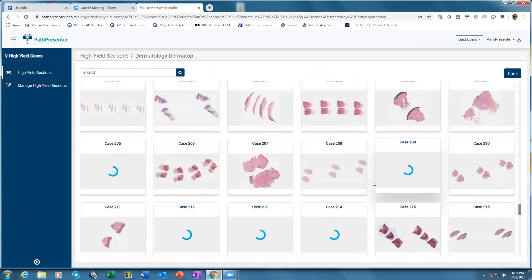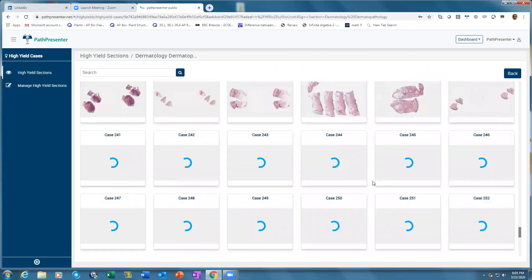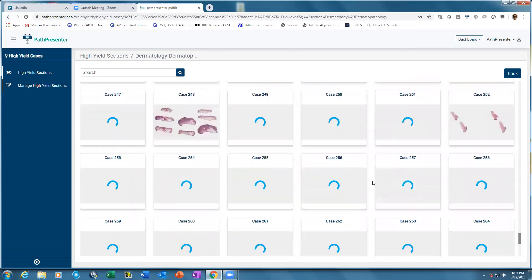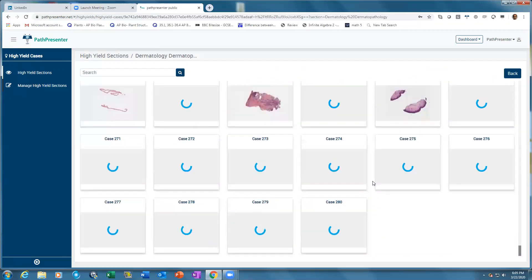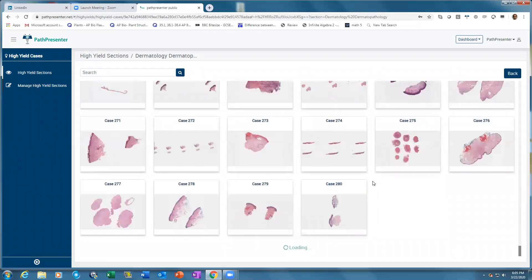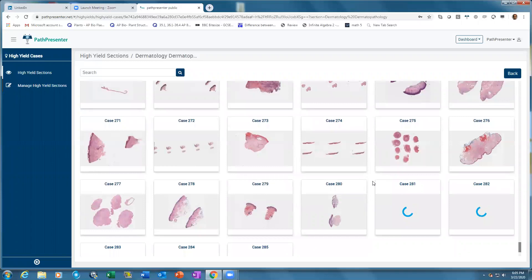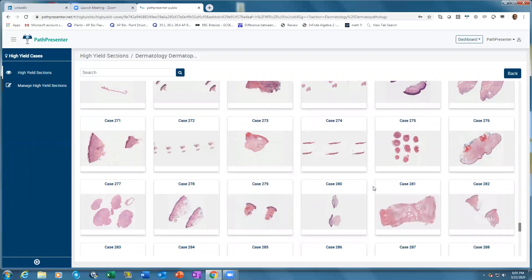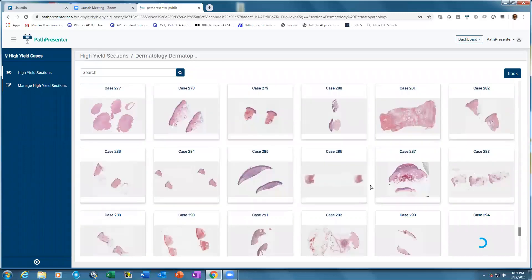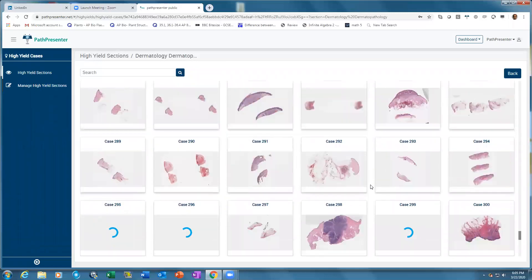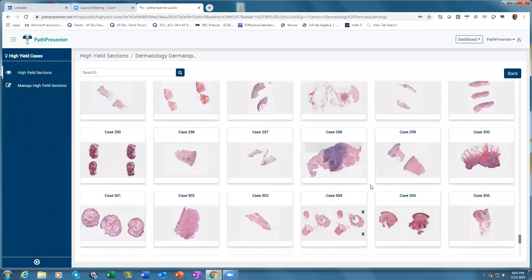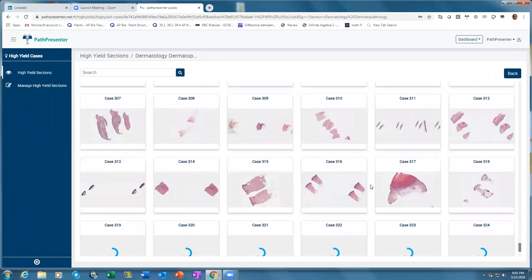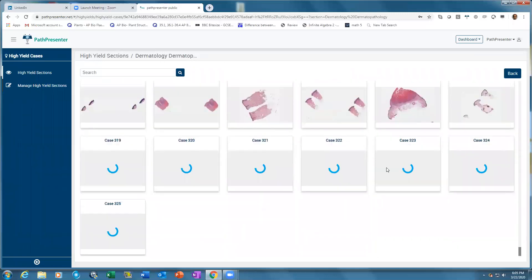In Derm Path, there are 325 cases that we have picked for you to go through over a period of three to six months before your board exams. Let's open up a case.